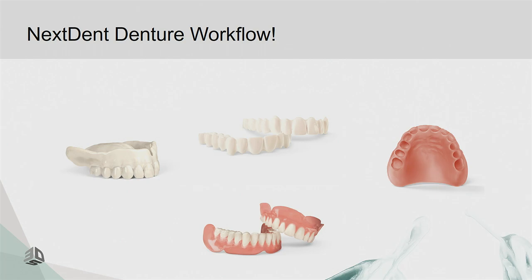And this is something that I want to explain because as a denturist, I know that sometimes dentures break, or after a couple of years, the fit is lost, so you have to reline or rebase them. All the materials that I've just shown are compatible with normal acrylics, the acrylics that we have been using for 80 years. So if a denture breaks or you need to reline it, you can go to a lab and have that done. Why wouldn't you print a new one? Well, let's say we're on holiday and something happens. They don't have a 3D printer, they don't have your file. You would want to go into the local dental technician lab and have them fix your dentures.